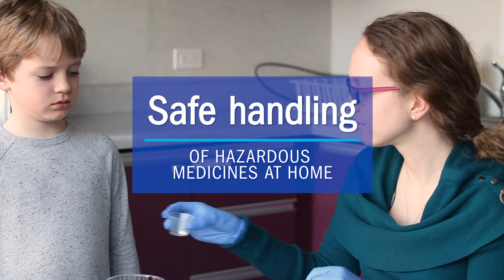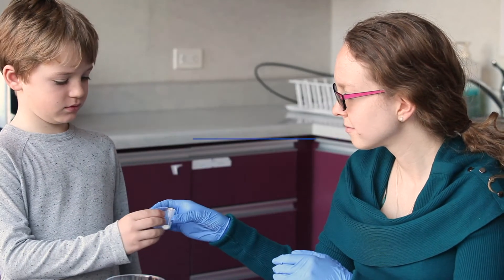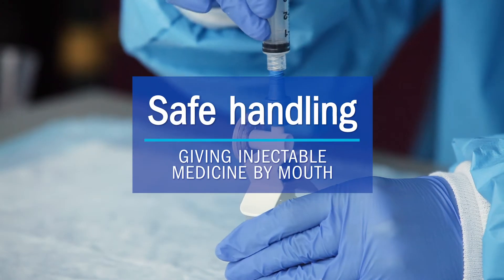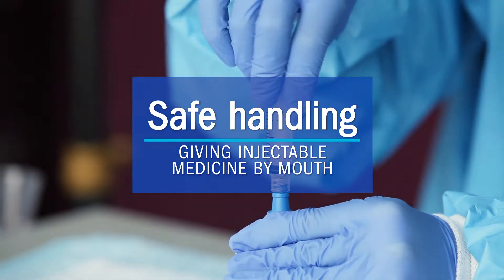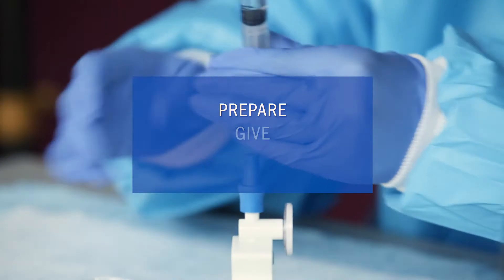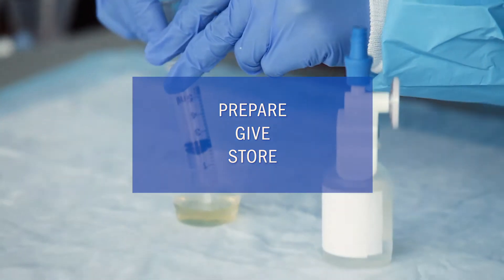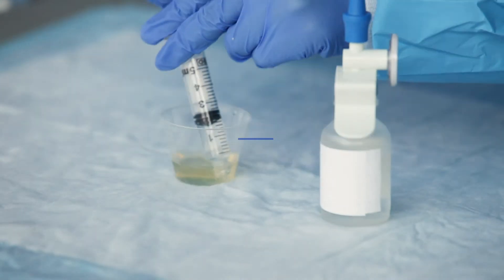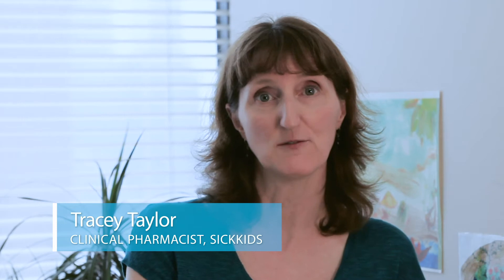Safe handling of hazardous medicines at home: giving injectable medicine by mouth. This video will show you how to prepare and give injectable hazardous medicine safely by mouth. Always follow these safe handling methods to provide the best protection for you and your family during your child's treatment.